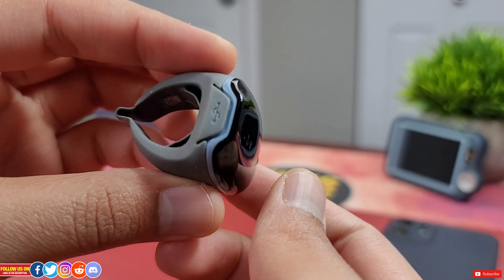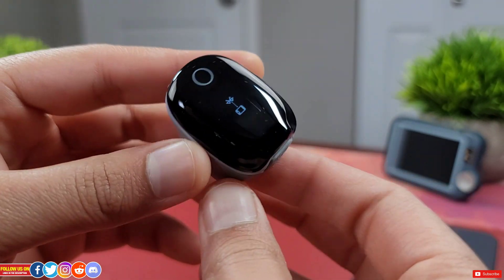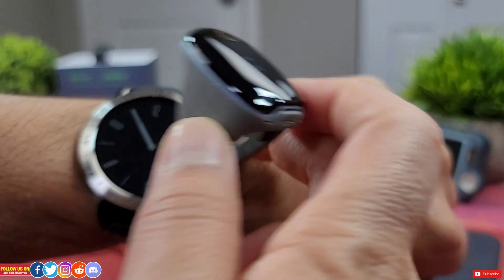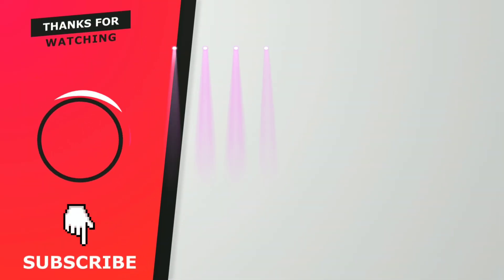Overall I can definitely recommend this O2 ring, and you'll see it in my upcoming videos for smartwatch heart rate, SpO2, and sleep tracking data comparisons. Give this video a thumbs up and check out these other videos — catch you guys in the next one.